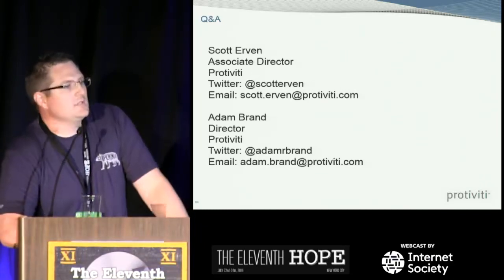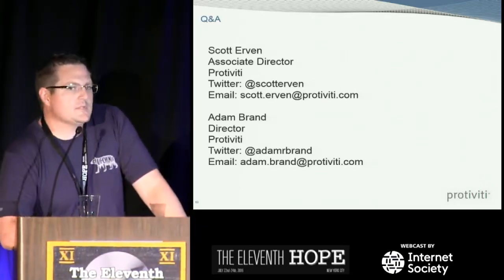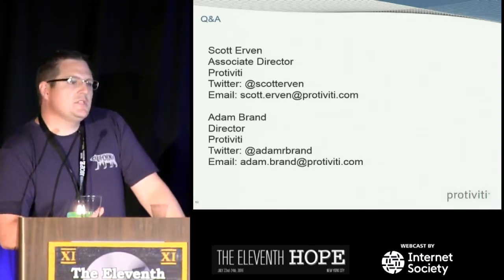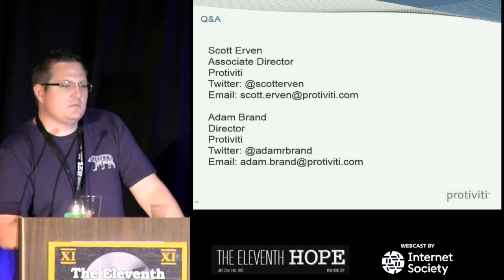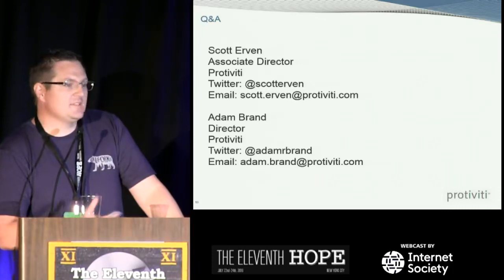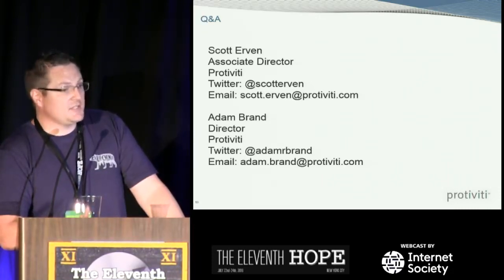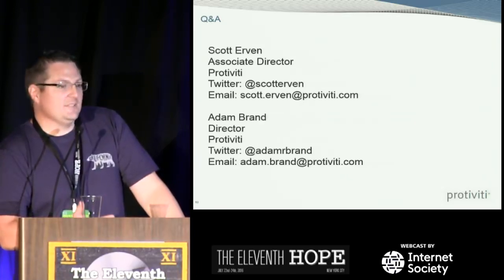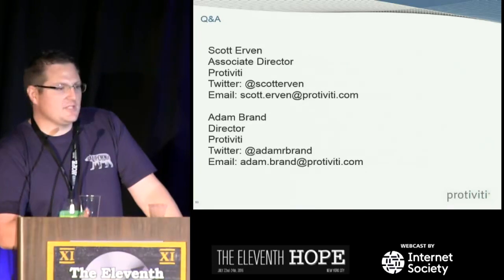So certain things, yes. Typically in disclosure, it'll go to CERT. In the early days, there wasn't really anyone that would even respond to us, right, when we would start to send in the disclosure. So then we just kind of started mass sending to everybody: HHS, FDA, ICS CERT. ICS CERT is the one that, rightly or wrongly, I don't know if that's the right place ultimately, but they started to respond to us and actually work through it.